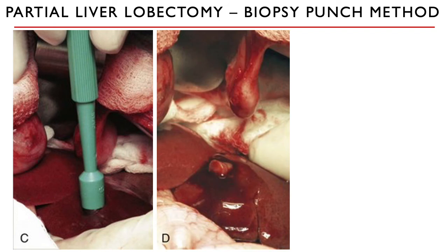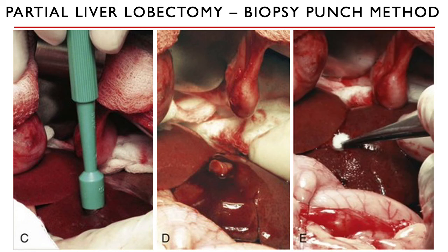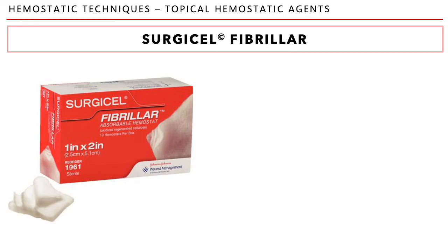Okay, so you remove that. Of course, bleeding would happen, and to control that, you can't just use gauze sponges. It's such a big tissue that you removed. So you can place gel foam into that hole, and it will control bleeding. It will swell and put pressure in that area so it won't bleed anymore. Okay, very easily used.